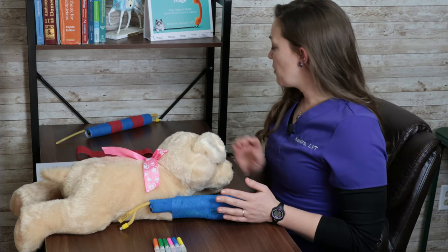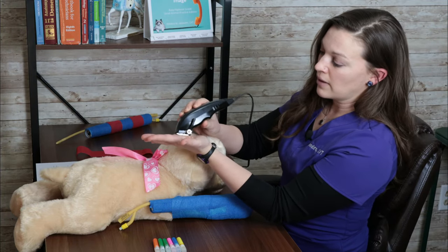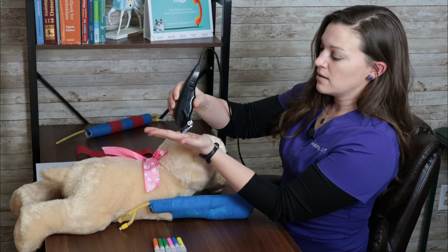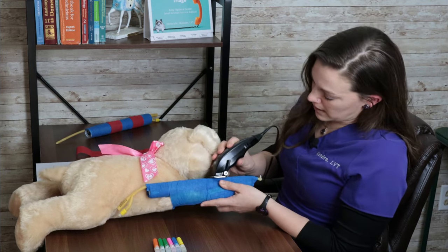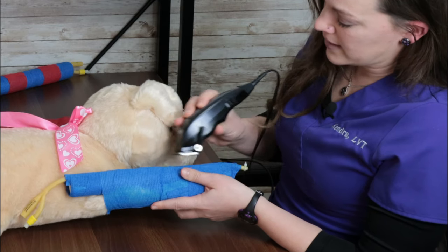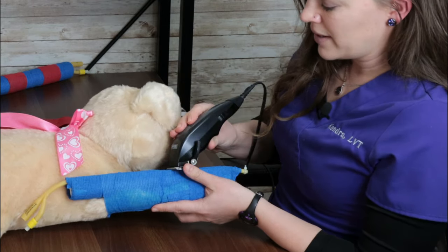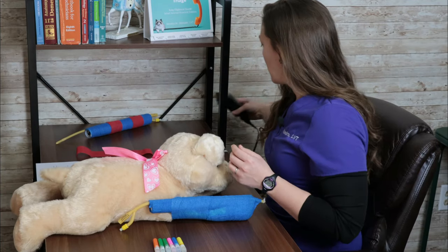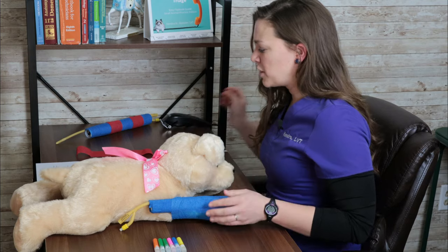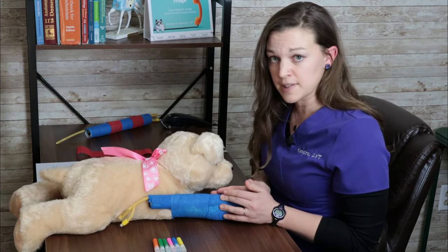I want to just take this moment to remind you that when we use clippers on patients, we always want to use the flat part of the blade in contact with their skin, not be angled up on the teeth. So with Penelope here, we're gonna keep this blade nice and flat as we're shaving. Once we get up into the teeth, that's where we run into causing clipper burn for our patients. So just be mindful of that when you're clipping up your patients. We do wanna do a generous area around the insertion site.